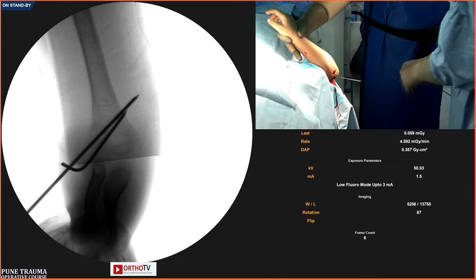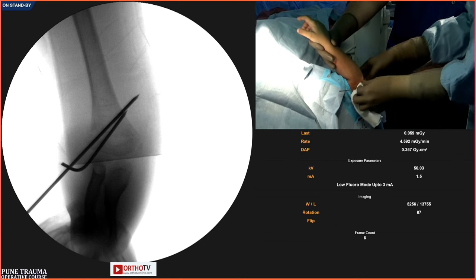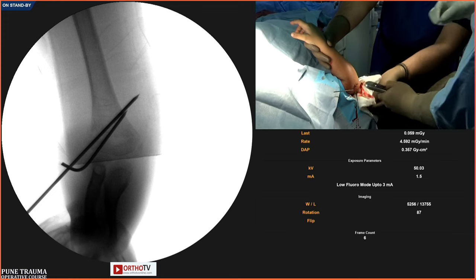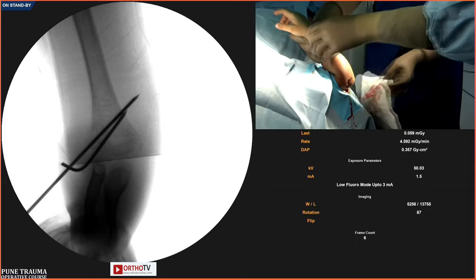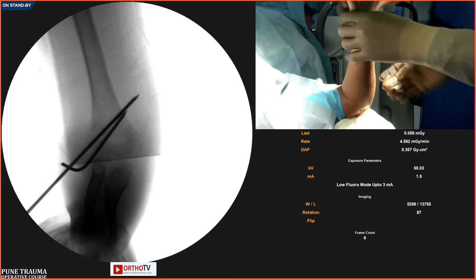Sandeep, this happens many times. You pass one wire and then you think it is not all right and you have to revise it. What I do is I take a skin marking pen and on the C-arm I draw how I want to pass my wire. Draw it first and then pass the wire, and I found that with that small practice, my struggle of having to revise the wire has become less.